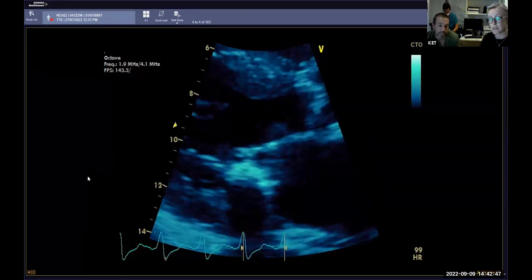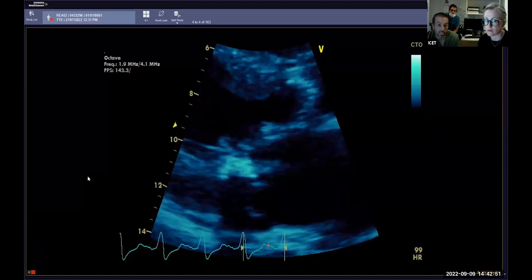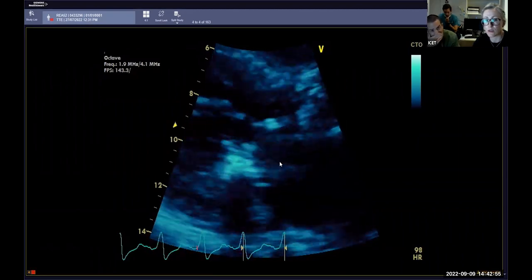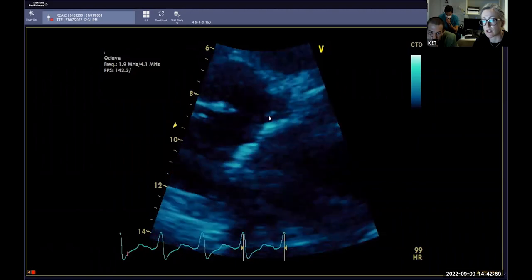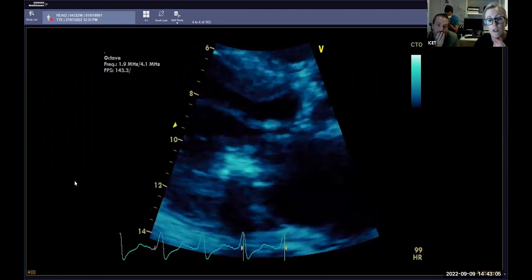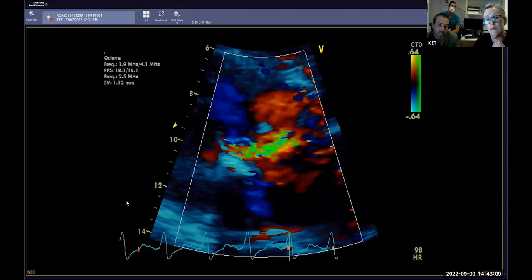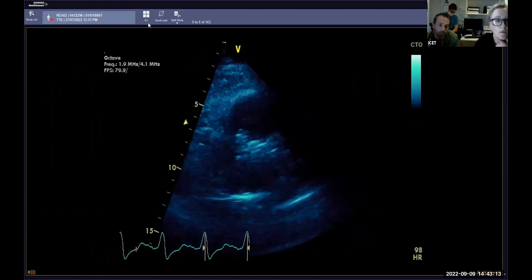No, I wouldn't expect to see severe mitral stenosis. I expect to see probably some mild to moderate, but I wouldn't be expecting severe just with ongoing calcification. Tell me what you would use to try to now grade the severity of the mitral stenosis. Sure. So mitral stenosis needs multiple parameters to assess the severity, to classify whether it's mild, moderate, severe.